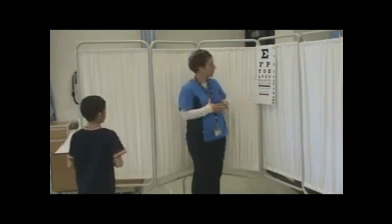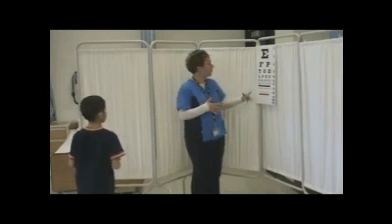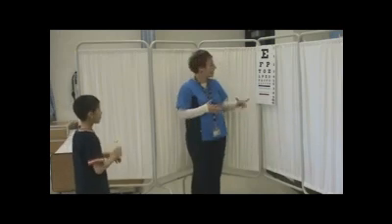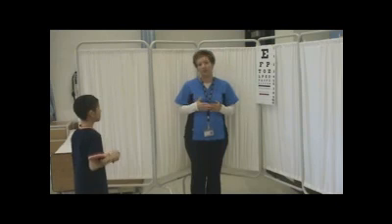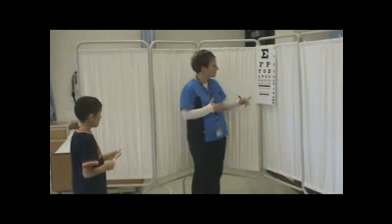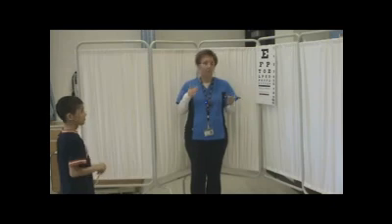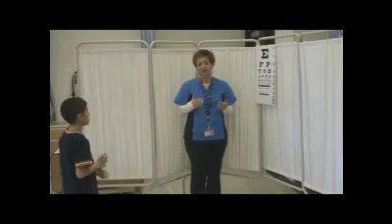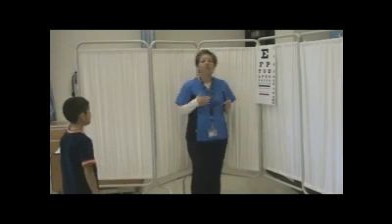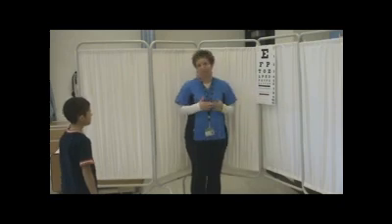When we tested Matteo, we established that his right eye was 20/25, his left eye was 20/20 minus 1, and together he was able to read 20/15. So we would record 20/15 and send that home to mom and dad. It is not uncommon for one eye to be a line less or more than what they are together. As I mentioned before, we would only distinguish between the left and the right eye if there was greater than one line's difference between the two.